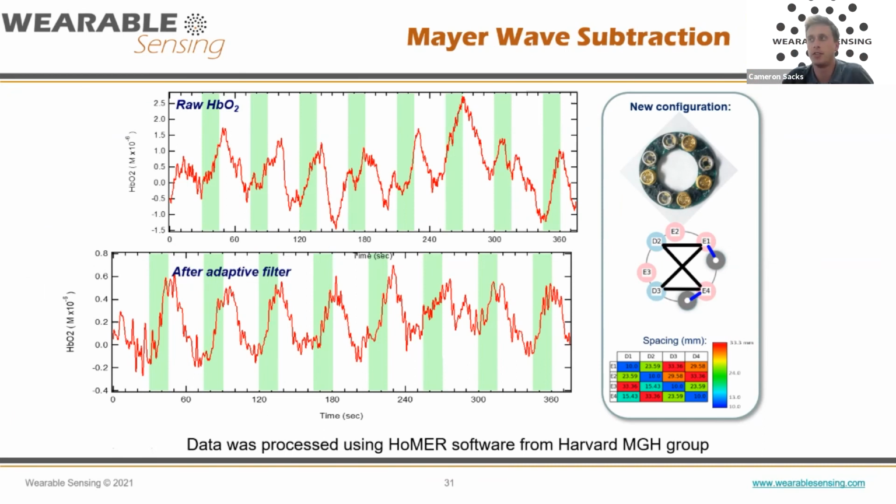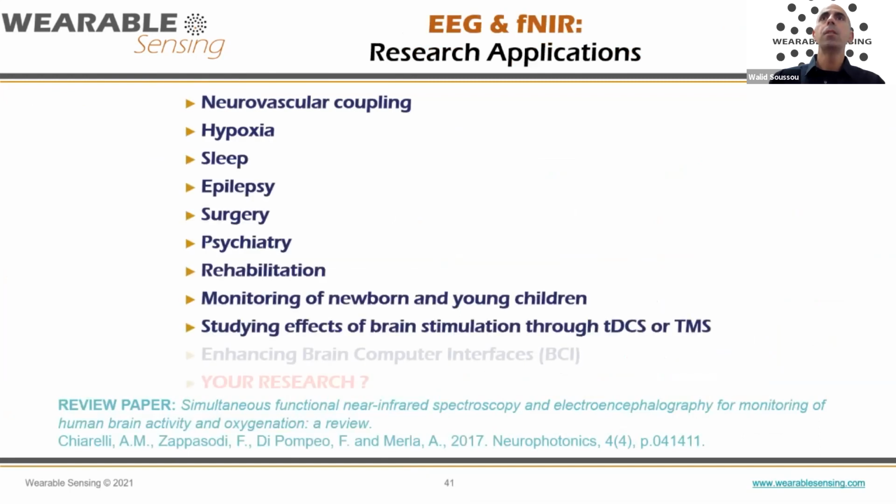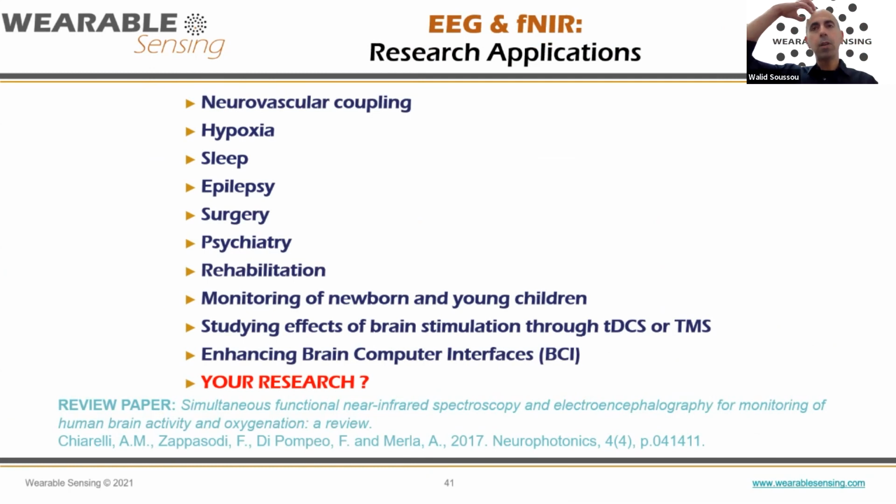Next question, is it possible to do EEG and fNIRs when using TMS? Yes, it is possible. It depends on which TMS device you're talking about. The small TMS coils, and forgive me for not knowing their exact name, that can be handheld or sort of small cubes, those are fine. Those do not produce any risks. The large TMS coils can produce very large magnetic fields, and we have the Faraday cage that could have some significant heating, so we don't recommend using the large TMS coils with a device. You can do TMS before or after, since the device is easily removed and easily put on, so you can quickly get measurements before or after the TMS, but not with the large coil TMS.